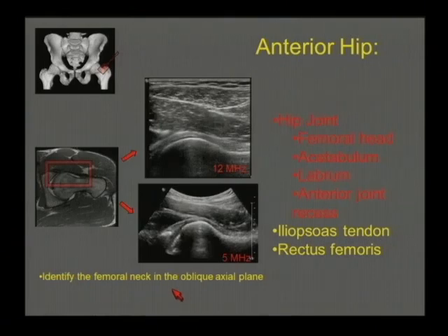All right, I'm going to start by talking about the hip joint. So where do we start with the examination? That's another important topic to go over. It can be a little intimidating when you're looking at structures like this for the first time, where there are multiple muscles, complex bony anatomy. It's important to find a place on the patient where you really know where you are and start from there.